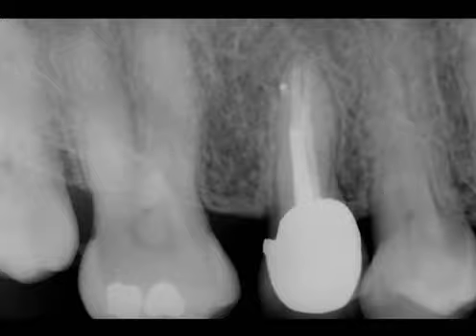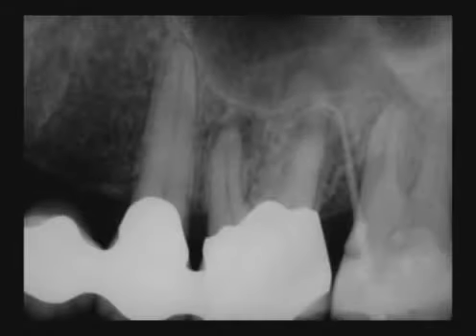and the recall at 7 years shows the inevitability of bone fill. Here is a preoperative film of a maxillary first molar posterior bridge abutment. Notice the gutta percha point tracing the sinus tract. Earlier in the show, we actually accessed this particular abutment, and I showed you the MB root. I mentioned that it was very interesting.